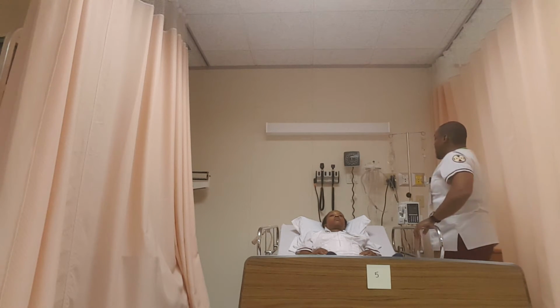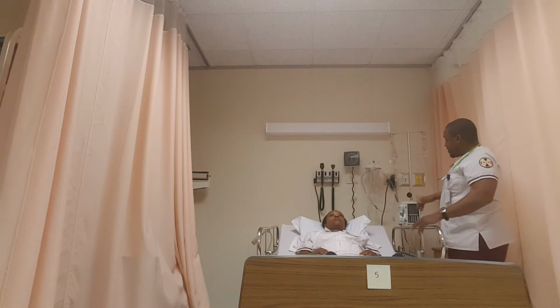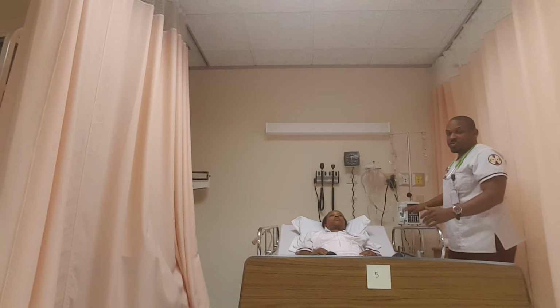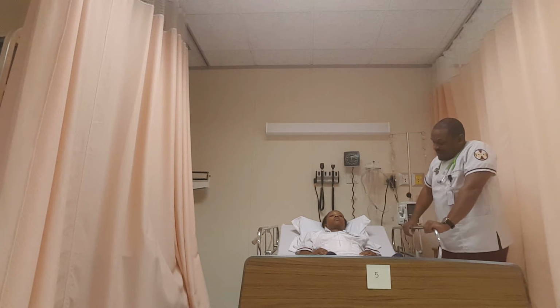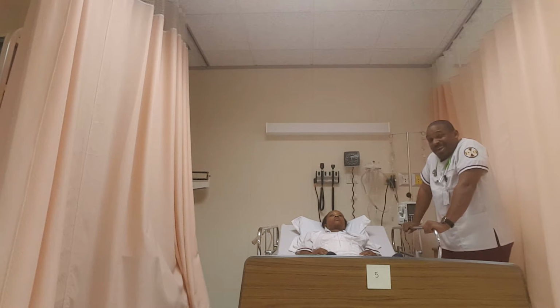The patient was on the IV. I would check her IV site, and then I would also check the machine to make sure the fluid rate is what's being ordered for her. Check the IV site to see if there's any pain, any signs of infection.